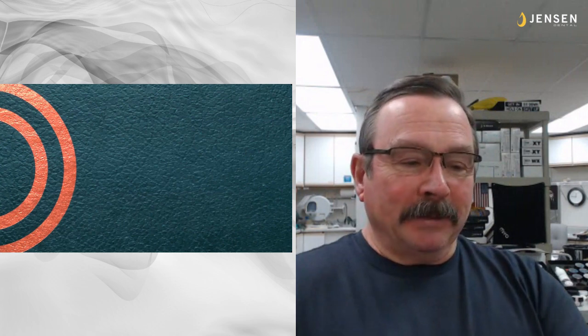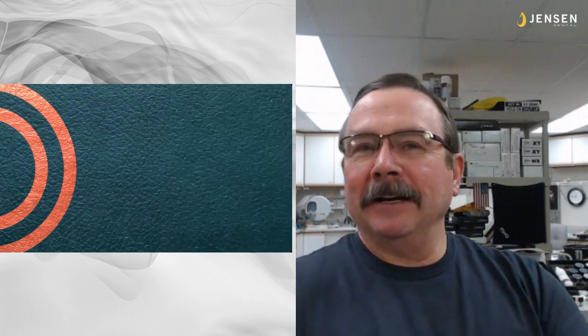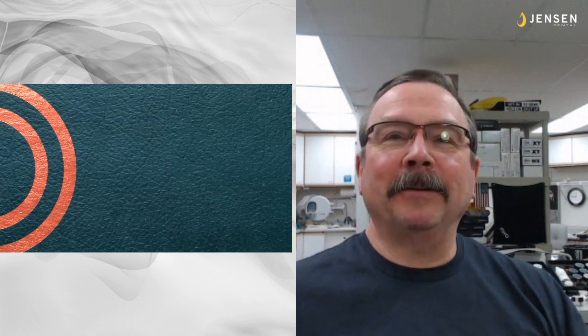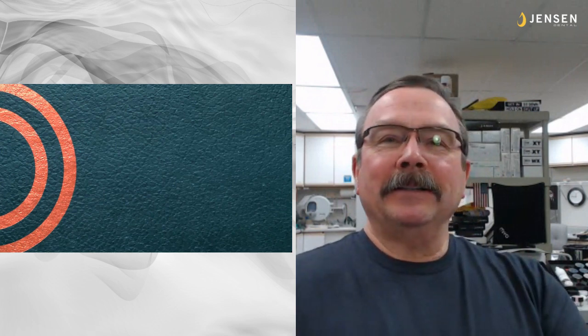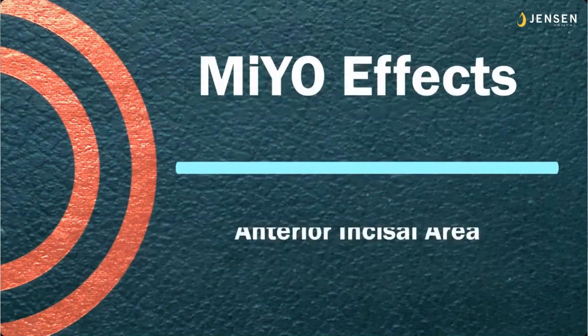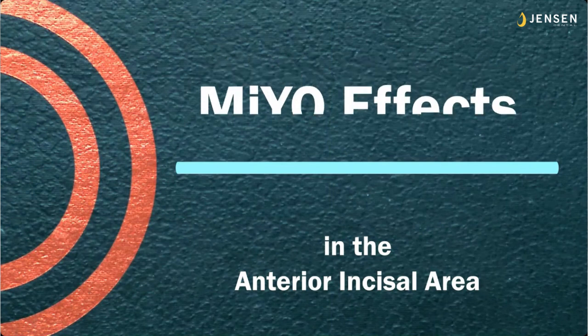Today's topic will be MiYO effects in the anterior incisal area, or actually pretty much at least half or two-thirds of the facial. So let's get started with this, and we'll let you get back to work. So again, MiYO effects in the anterior incisal area.